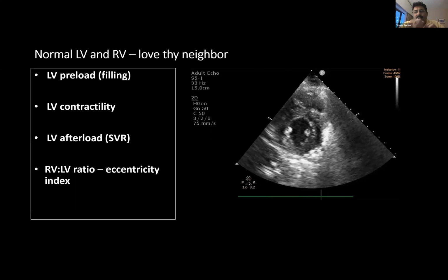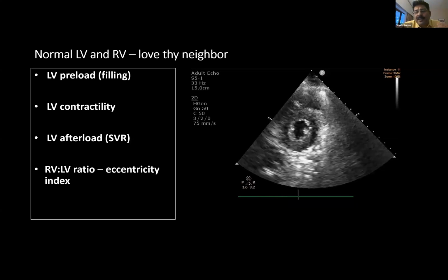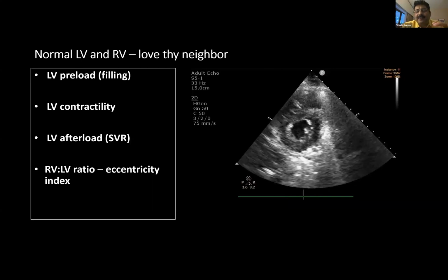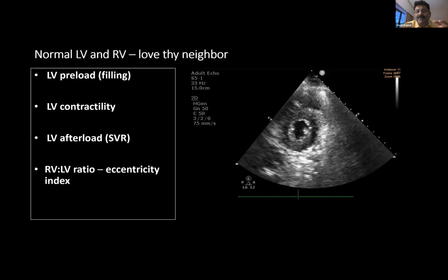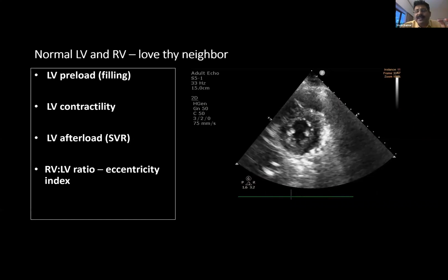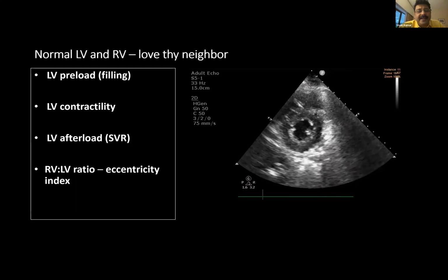But when it is moving in with a much more vigorous force, it is not crumbling in end systole. So if you have a hypovolemic patient, you will find that the heart moves in very fast, but the papillary muscles kiss each other in end systole. But if you have gross vasodilatation with relative hypovolemia, you will find that the heart, by God, moves in very fast, but the papillary muscles don't kiss each other in end systole.